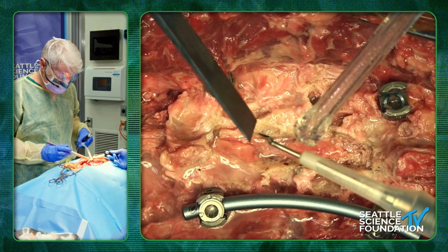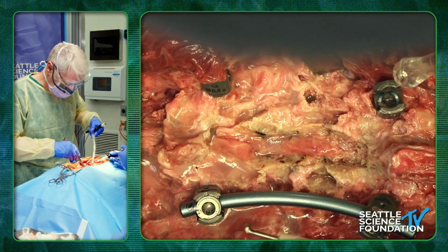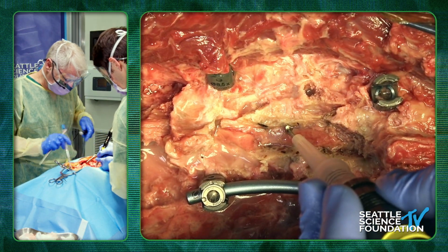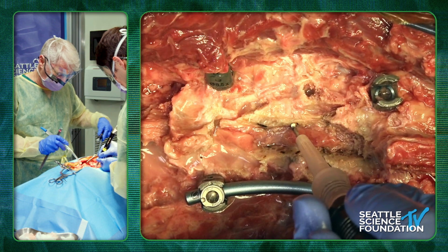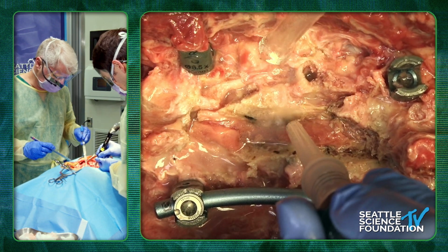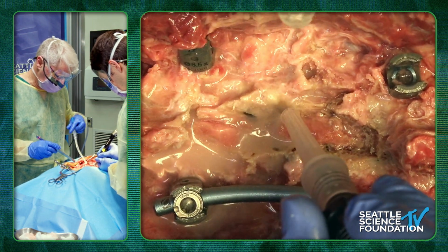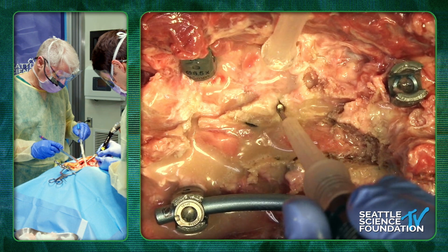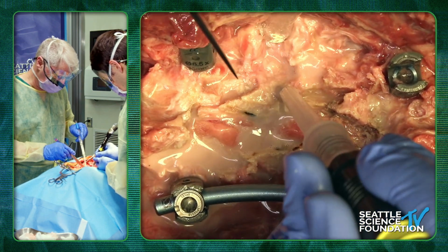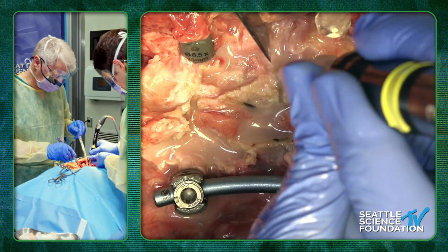This one is shaped like a Kerrison, and you just use it like a Kerrison, and so he used it right across here, and he's going to do it again, just as if he's using a Kerrison. He's going to separate and cut the pars out, and we'll find the nerve root right underneath there. So it cuts really nicely, usually not associated with much bleeding. Come right through the pars.